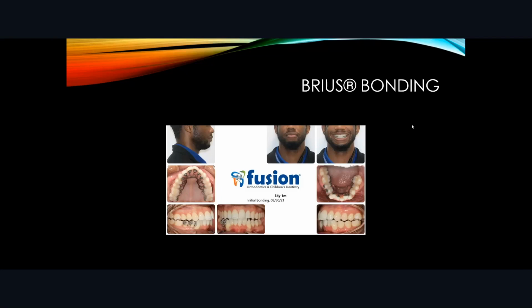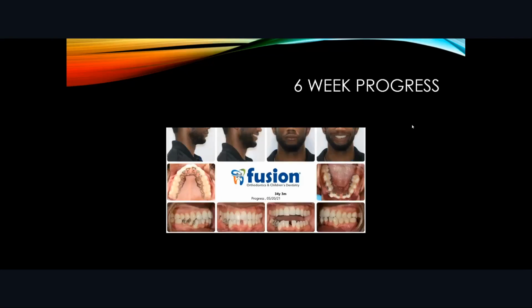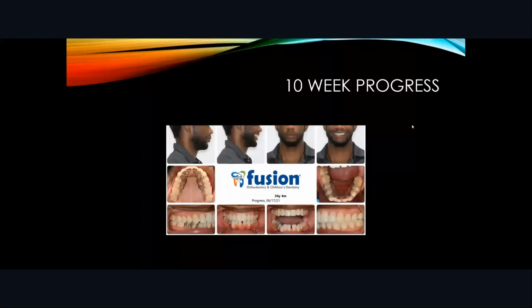So in May, you can see the progress. The patient just removed the tooth. This is 6 weeks into the treatment. And then in June, you can see this extraction space is down to less than 2 millimeters. One thing to note is how well the bone architecture is maintaining that area.